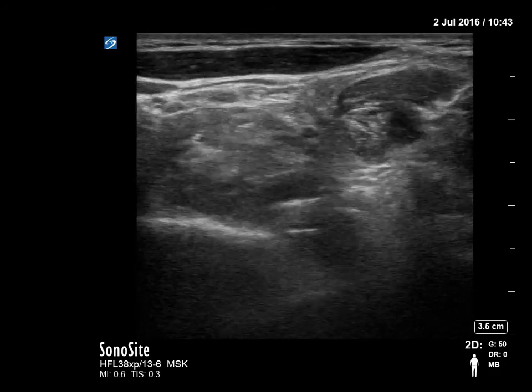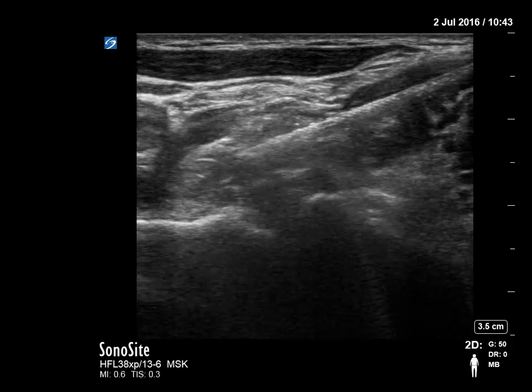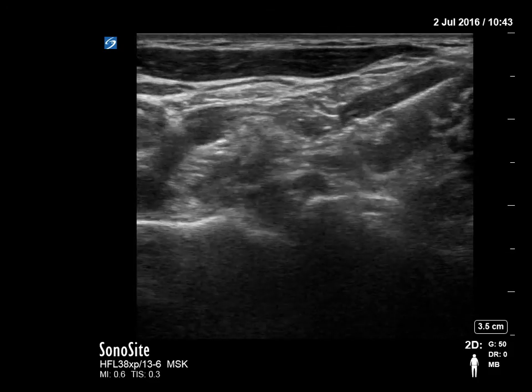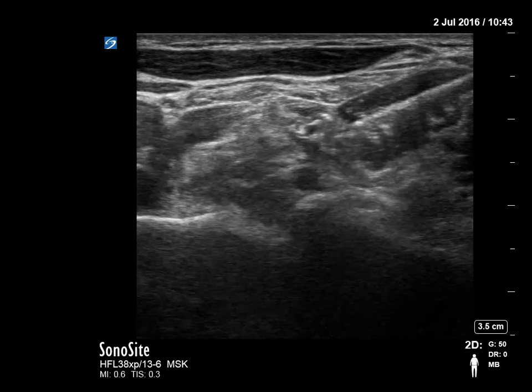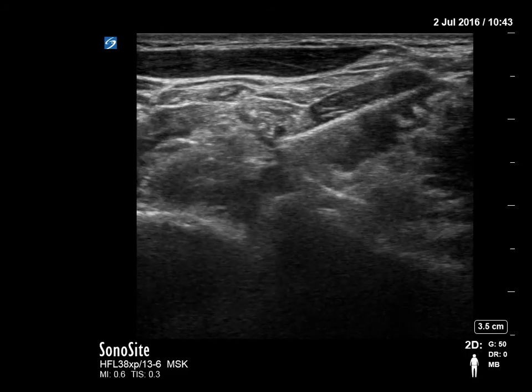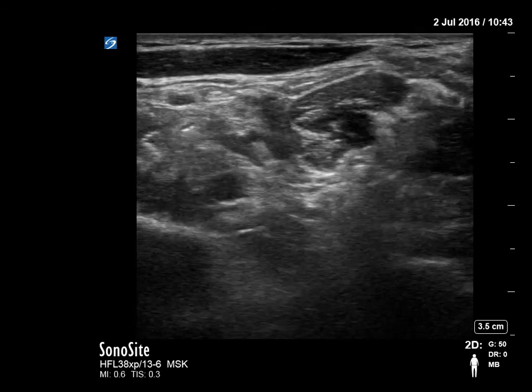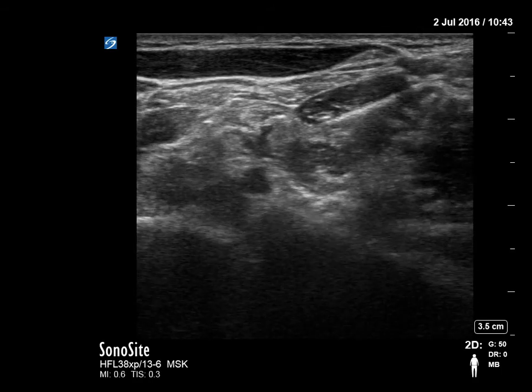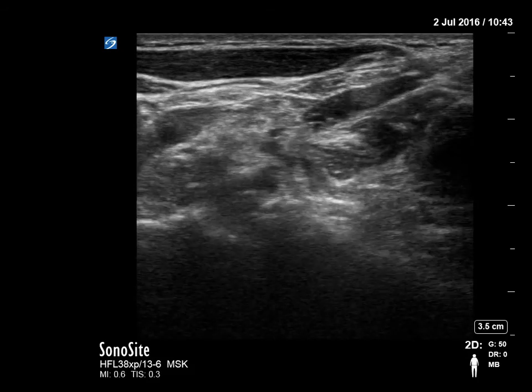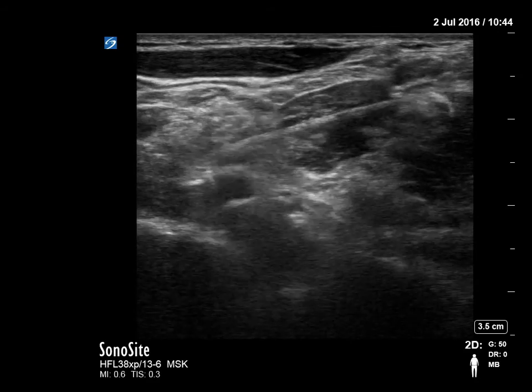But if you see carefully, this needle which looks intramuscular is actually at the end or upper surface of the longus colli muscle, where, posterior superior lateral, you see there is something, the needle is going below an artery or vein-like structure. Actually this is the phrenic nerve, as we found out later on. You try to avoid the phrenic nerve. Most of this is the vertebral artery, now beating. So what I will try to do is deposit some of the drug there, avoiding the phrenic nerve, not injuring it. All right.